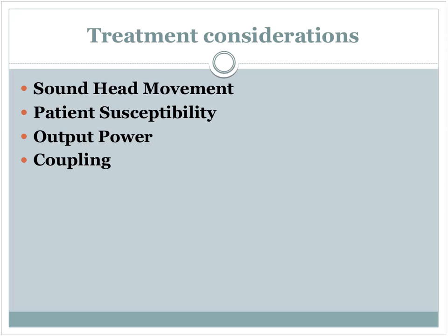So you think about that, most of our sound heads are a 3 square centimeter sound head. And that means you look at the size of the sound head, and you put 2 more next to it. So that's the whole area that you can treat effectively, is what they're saying. And you need to keep moving within that area, okay? Otherwise, you're not really generating enough heat.